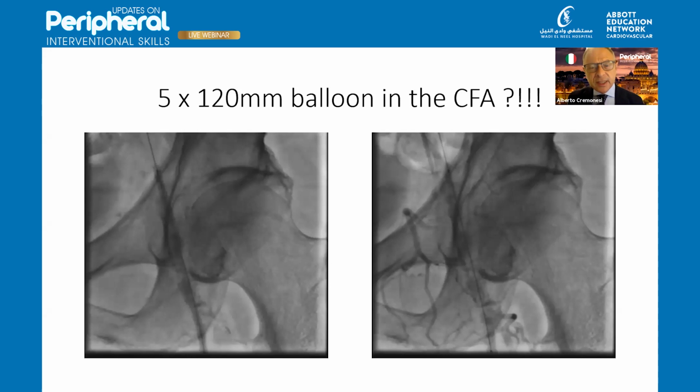In my mind, it is absolutely perfect. I mean, never stress a very calcified lesion too much. That was the point. I was pretty frightened. I was freaking out because of the over-ballooning or over-dilatation of the femoral artery, and I understand that the profunda femoris artery is a very respectable artery, and I cannot sacrifice it under any circumstances.